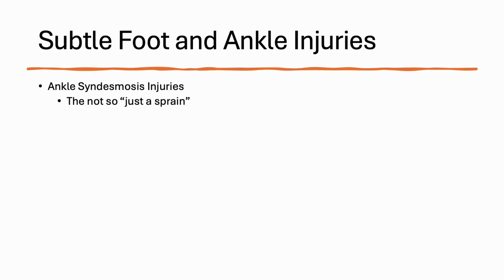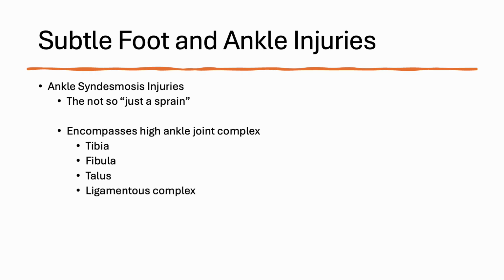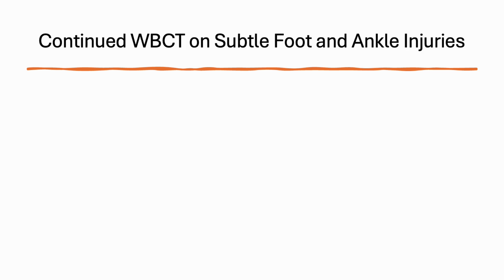Subtle foot and ankle injuries. Ankle syndesmosis is usually the one I get weight-bearing CT scans on. It's not just a sprain. The syndesmosis is a complex joint. It encompasses the tibia, fibula, talus, and the ligamentous complexes.